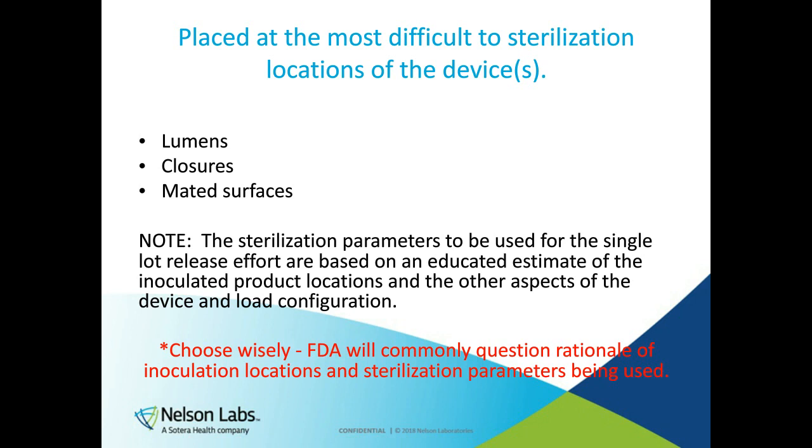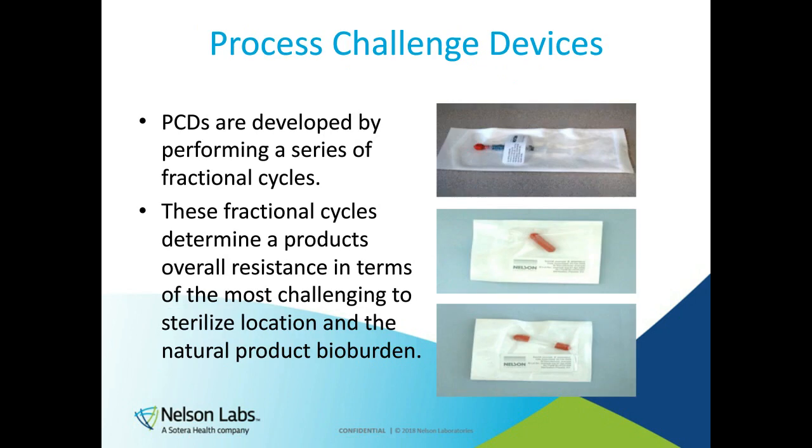The other method of monitoring the sterilization process is via the process challenge devices. These process challenge devices are representative of your product's resistance. In order to develop a process challenge device, or a PCD, you must do upfront testing called a comparative resistance and a bioburden resistance.